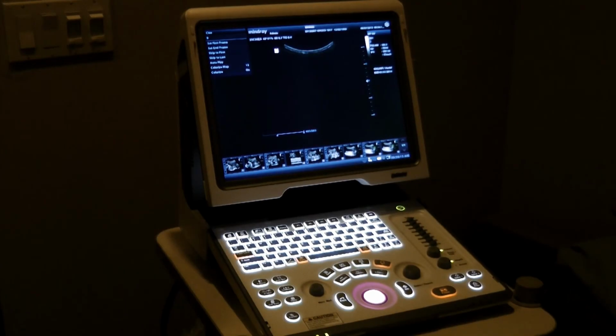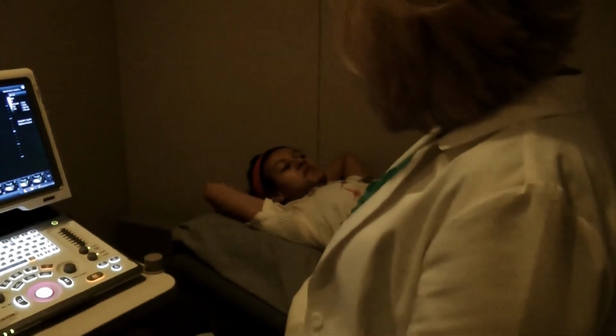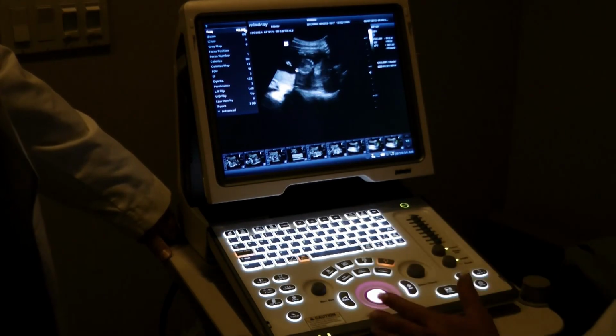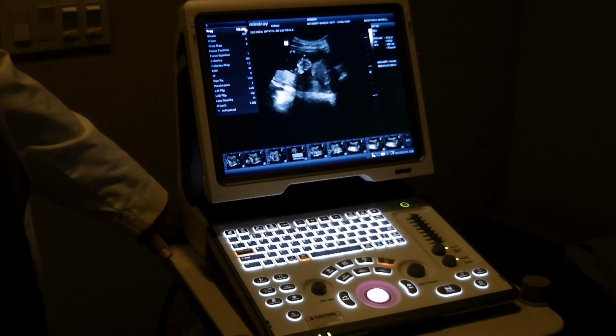All right, well, this is Brianna. Brianna's like 14 and a half weeks. Thank you for coming, Brianna.